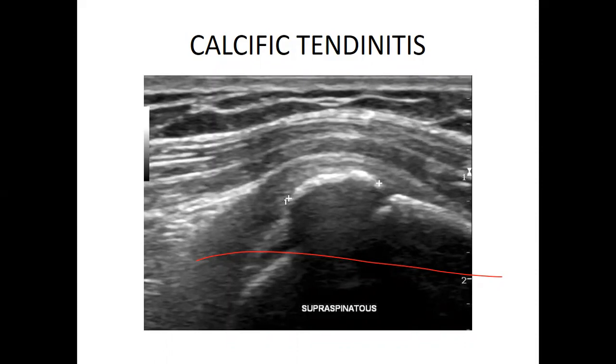Remember, these patients are coming with a clinical question, so a clinician who is sending that patient must do a thorough assessment. My job as a sonographer is to look at the appearance. I may not see the actual recurrent dislocation, but I'll look at the mechanism.